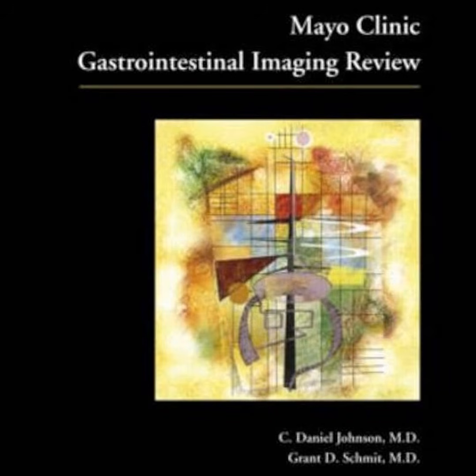Okay, based on the anatomical watershed location and that ominous presence of venous gas, the diagnosis is ischemic colitis. And the mechanism is a low perfusion state or vascular occlusion that is actively starving that vulnerable terminal arterial zone of oxygen, leading to transmural infarction. Beautifully explained. We really hope this deep dive has sharpened your clinical eye, demonstrating just the profound amount of data hidden within the shadows of a scan.